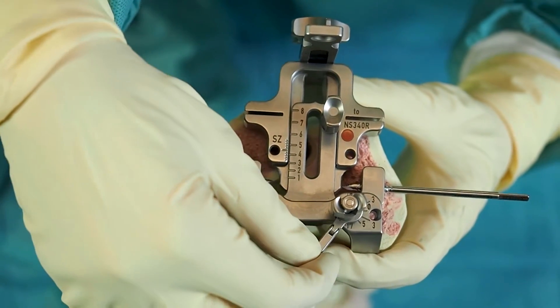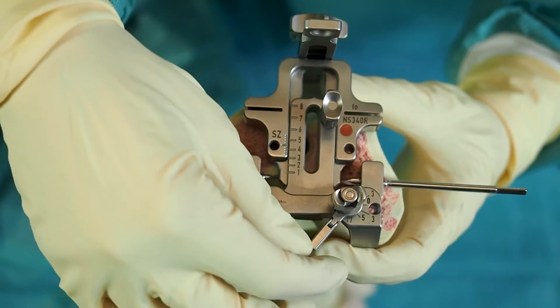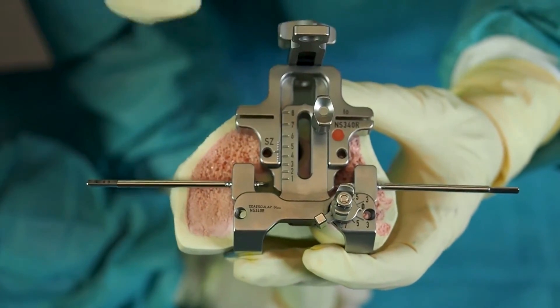It is possible to adjust the external rotation by manipulating the posterior lever arm — clockwise for right knees, anticlockwise for left knees. Rotation is fixed by tightening the screw at the bottom lever arm.